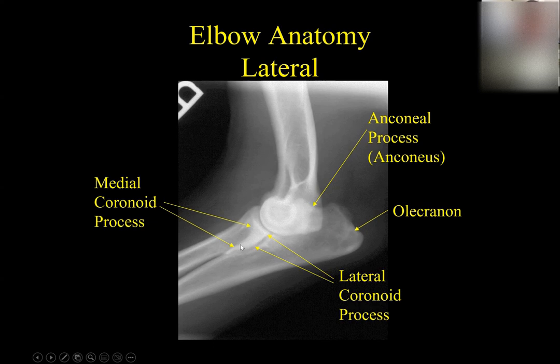And then we get to these little ridges over here. This big one, the medial one and the major one, you can remember that because M starts with medial and major. So the big swooping ridge is this line of the ulna right in here. And it has to look just like this and be well defined. You trace this part of the ulna, it comes up here, and it forms like a well-defined ski tip looking thing, a nice little point on it. That is the medial coronoid process. That's the one that causes the problem.